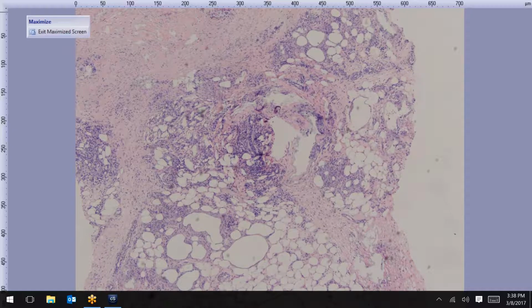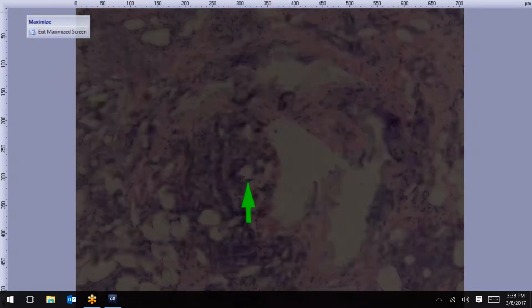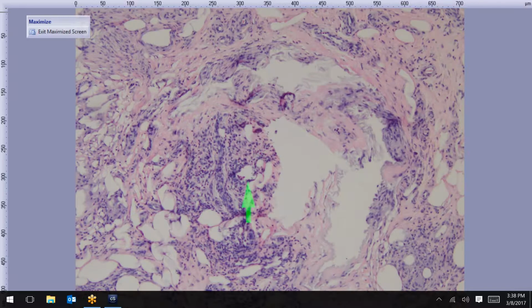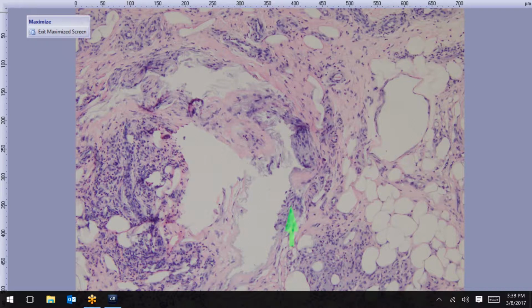And let me just turn on the pointer to see if that works okay. There we go. And you can see that there's a lot of inflammation right here in primarily the lobules. So there's some fat degeneration, and as we go a little bit higher, there will be a nice focus here that I can point out that's pretty classic for this condition, and it's right centrally here.